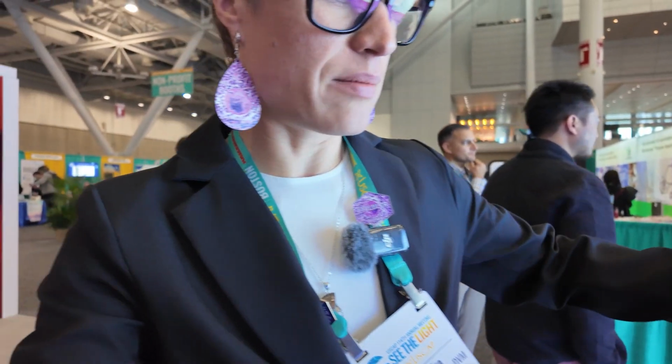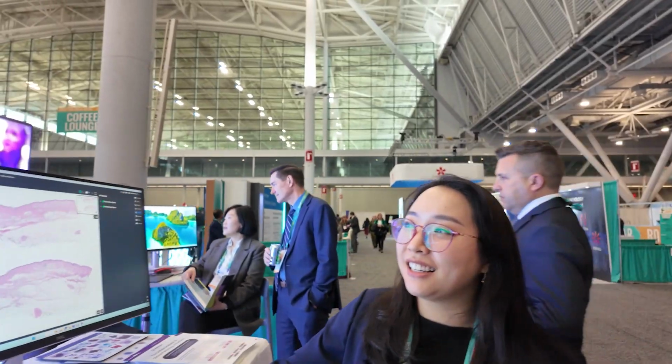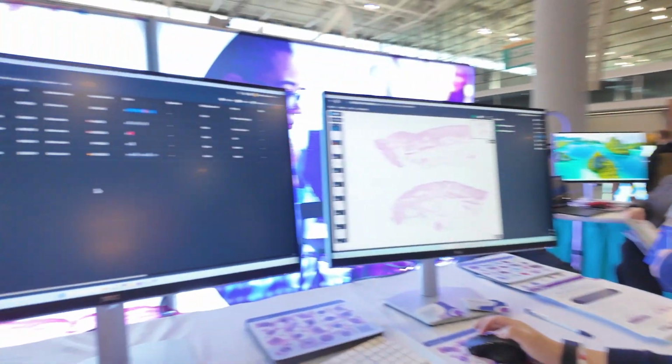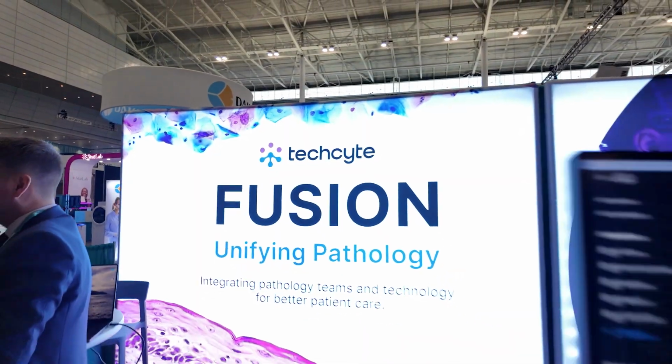A quick demo of the software version. So Tiffany, welcome back. Hi. Thank you so much. All right, we're really excited. What's Techcyte Fusion? Yep, that's what we're talking about.